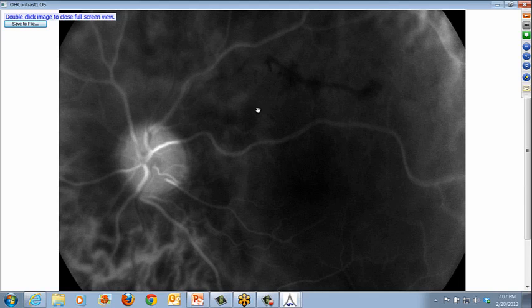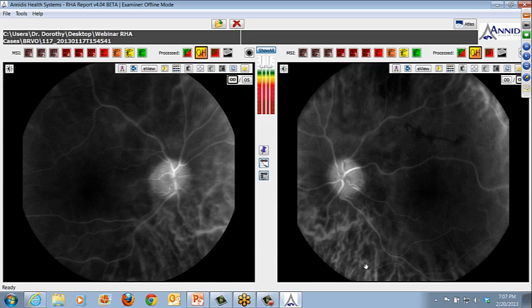hyperreflectivity towards the macula, because as we all know, that's a potential space for fluid collection. So the mechanical as well as immunoinflammatory reasons that fluid will collect there. And so you cannot always perfectly rely on determining whether or not there is CME there. But this again is a patient you would drive to OCT, you would use your clinical clues, you would look for fluid on ophthalmic exam, and you would look at their acuity and monitor carefully.